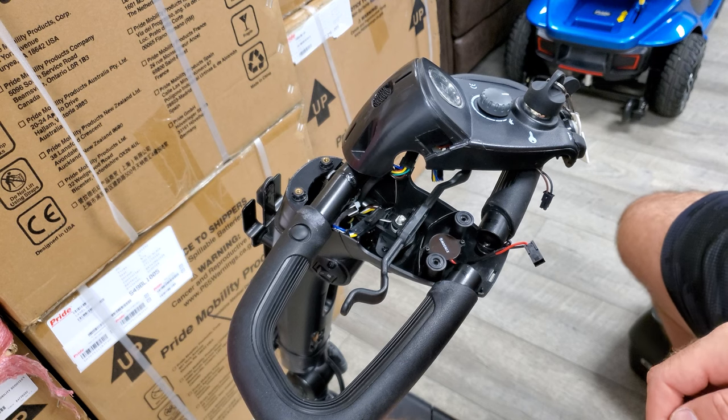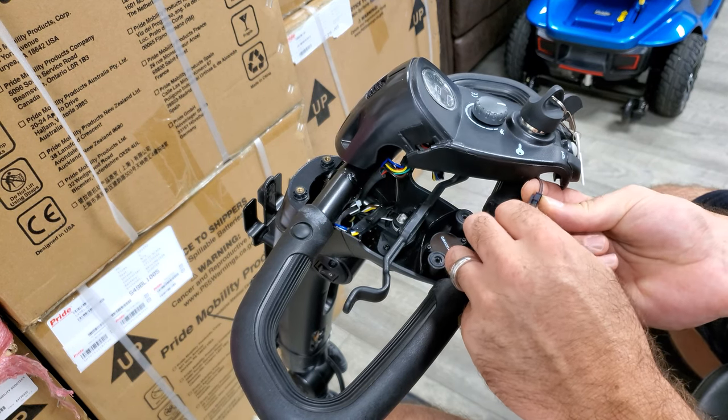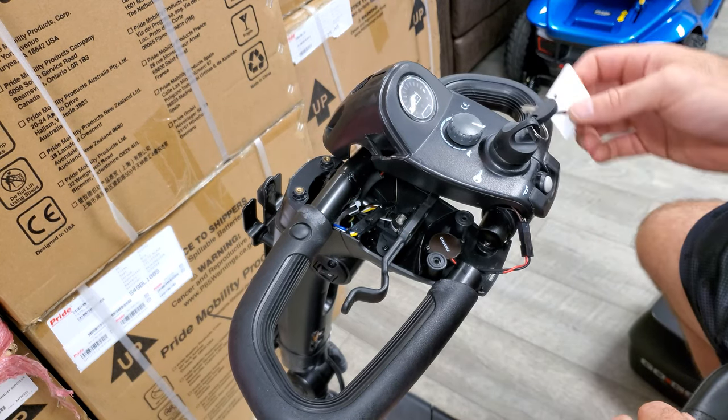Once we have it screwed back in, go ahead and connect your wire harness. We want to go ahead and put our batteries back in and do a function test.